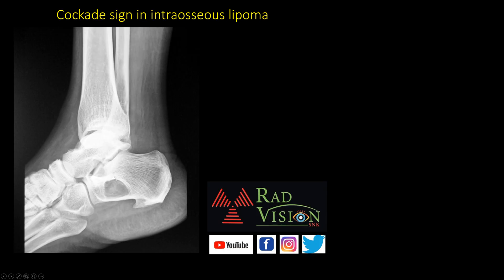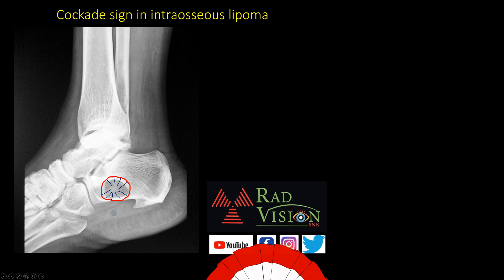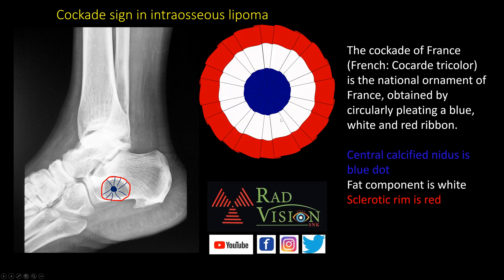The last case: a hypointense lesion surrounded by a thick sclerotic rim with a central hyperintense nidus in the calcaneum — typical of an intraosseous lipoma. This resembles a cockade. In the cockade sign of intraosseous lipoma, the central calcified nidus is the blue dot, the fat component is the white component, and the sclerotic rim is the red component. The cockade is a French national ornament worn on hats or dresses, made by pleating a blue, white, and red ribbon. Remember the cockade sign for intraosseous lipoma.